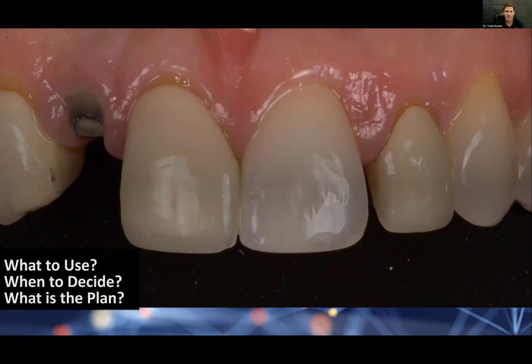So think about adhesive dentistry. When do you decide how you're going to use materials? Do you decide the day the patient's already been prepared and in the chair and the ceramics coming back from the lab? Is that the time we make a decision on what we're going to use and how we're going to put things in? Or do we decide the day we temporize things? Or do we decide the day we treatment plan? When we're presenting a treatment plan to the patient, are we already deciding at that point in time what it's going to take to do things, how we're going to be adhering things, the materials that might be involved, and therefore the price that must be derived from all of that? So at what point do you decide what materials you're utilizing?